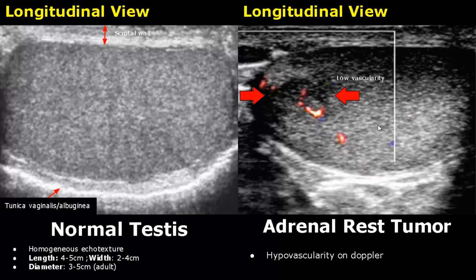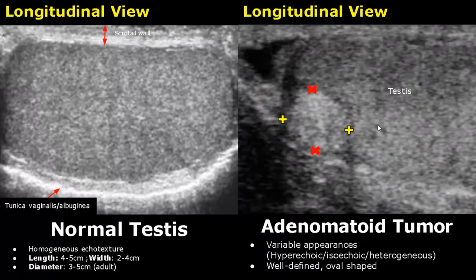Adenomatoid tumor has variable appearances — it can appear hyperechoic, isoechoic to the testis, or heterogeneous. Usually it is well defined and oval shaped.